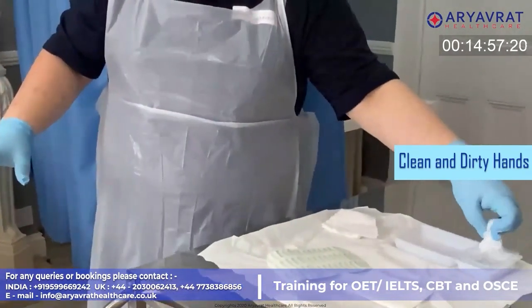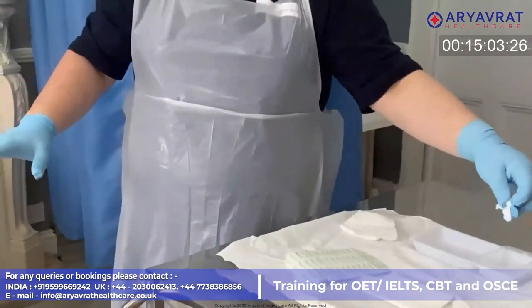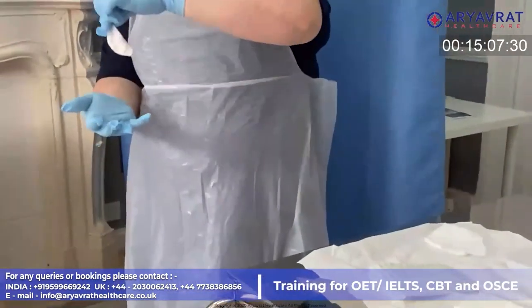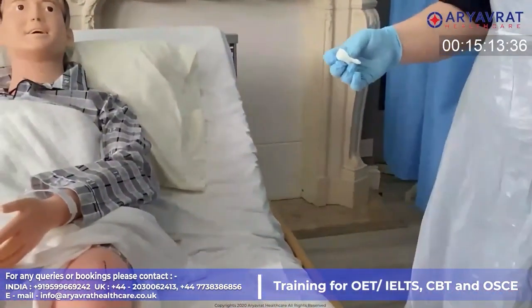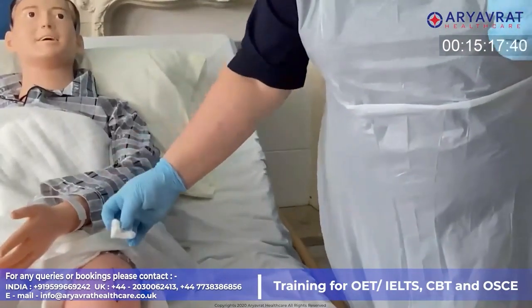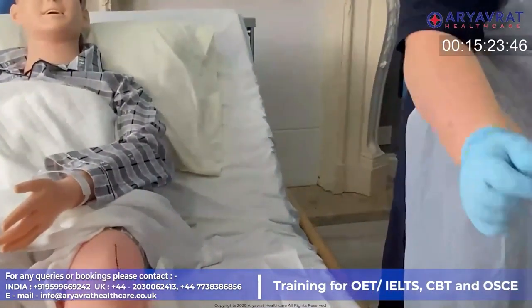Take one piece of gauze, I'm going to squeeze. As we've already assessed Raj's wound, and we have been aware that it is appearing to heal nicely, I am going to clean in a linear fashion from the cleanest end to the dirty end in a linear motion, and dispose in the rubbish.